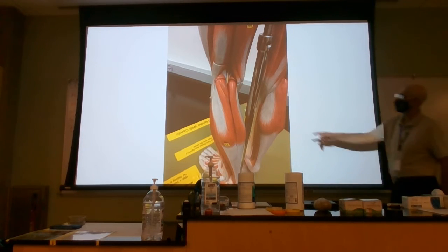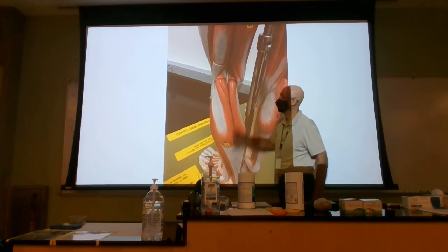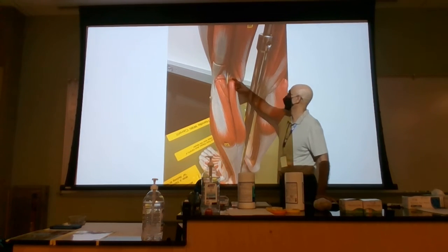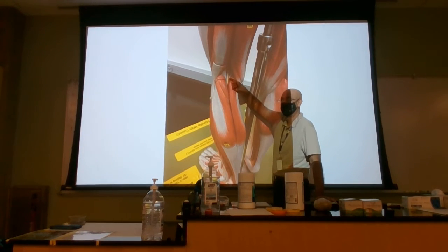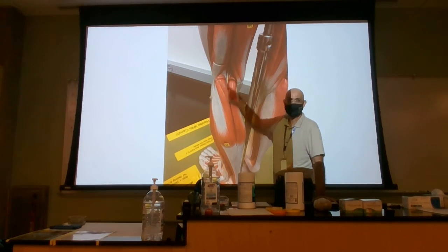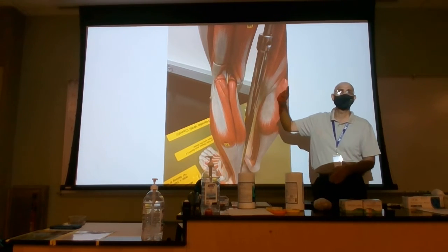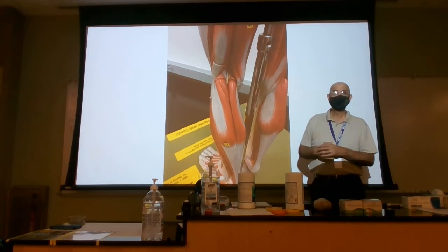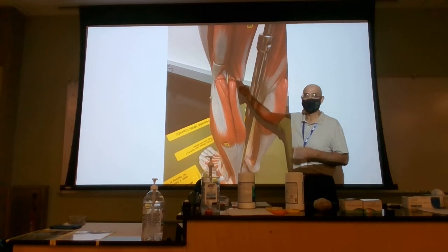What is the name of this red structure? Popliteal. Okay, well, let's say this is your exam, right? The full name for this. Left popliteal artery. Yes, left popliteal artery. You should mention left and right. You should mention artery and vein.